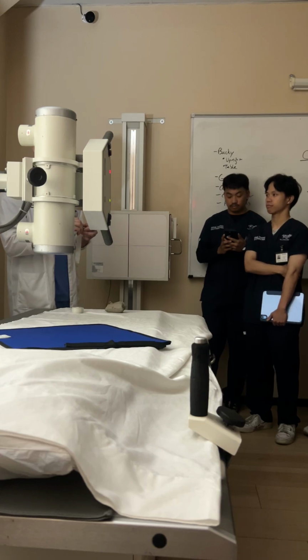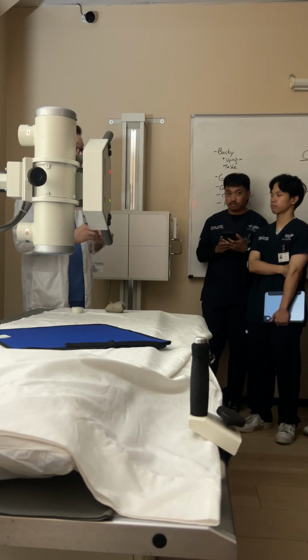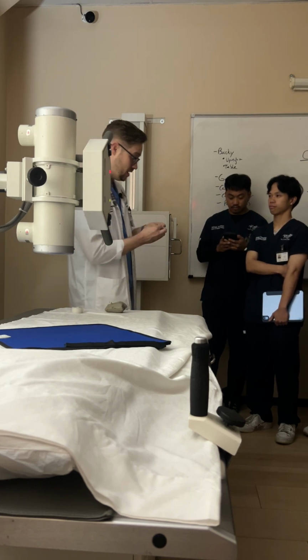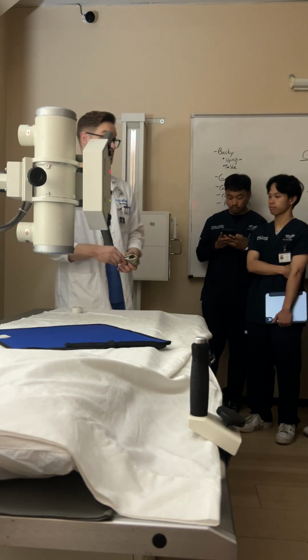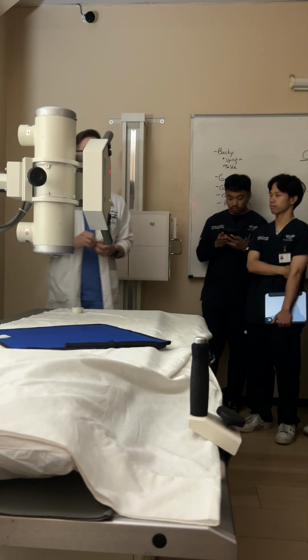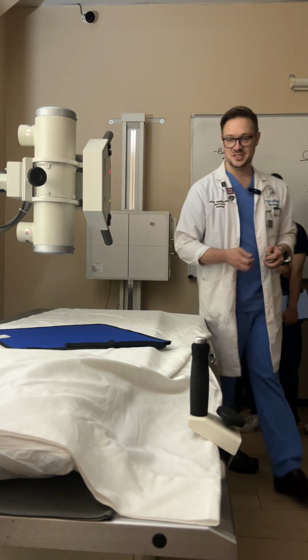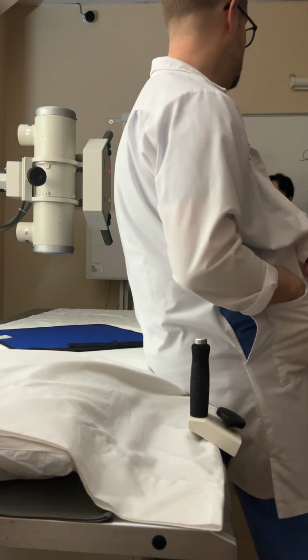So, real fun fact, real quick. You would be surprised how few of the general population know what the word exhale means. So when I say in my lecture, dumb it down, keep it really, really simple, I mean dumb it down, keep it really, really simple. Take a deep breath in, blow that breath all the way out. Take another deep breath in, hold it, don't move, don't breathe. That's exactly what I've said for 20 years. Nothing changes in that. And there's no ambiguity there, right? You can't confuse that, right?